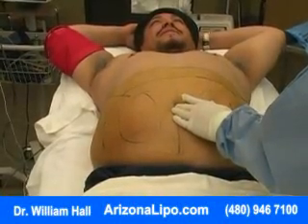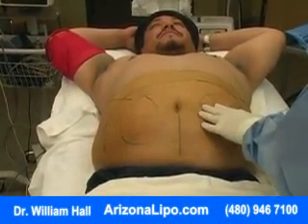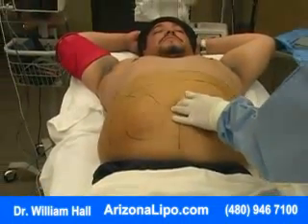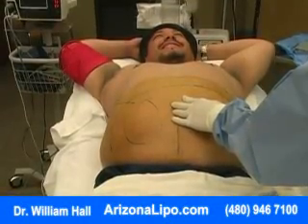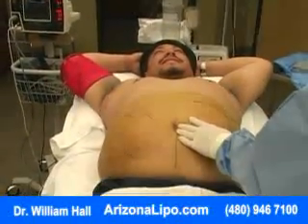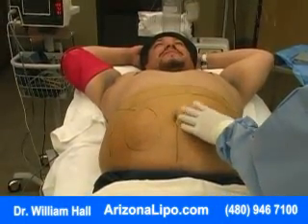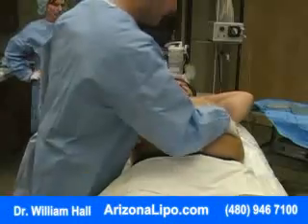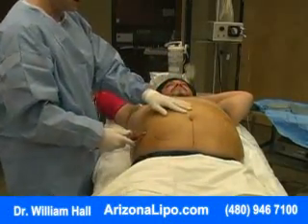I feel something. Yeah. I mean, it's not like... There's not a lot of nerve endings in the fat compartment. That's why we can do this. It's no worse than plucking hairs off your face. Right. It's just a little uncomfortable at times, but it's never anything. Feels like just being in a shower or something like that. So right when we're done, we'll let it set up for probably 10, 15 minutes, and then we'll be able to start the suction.